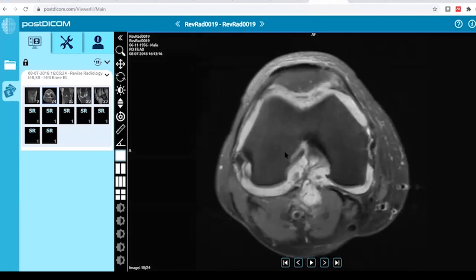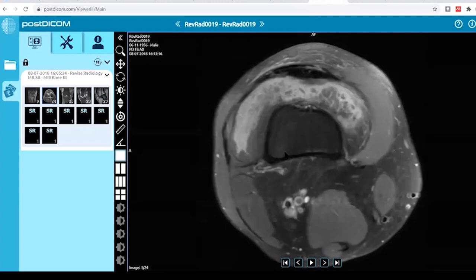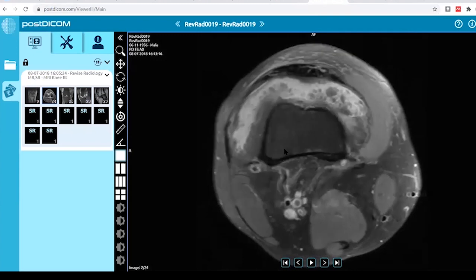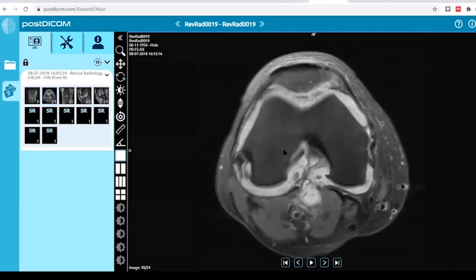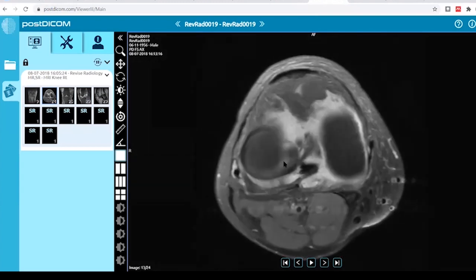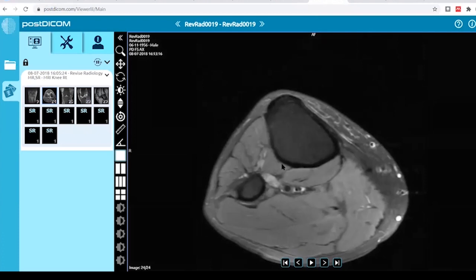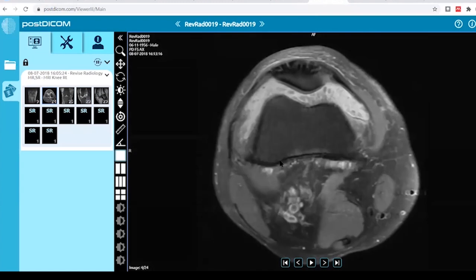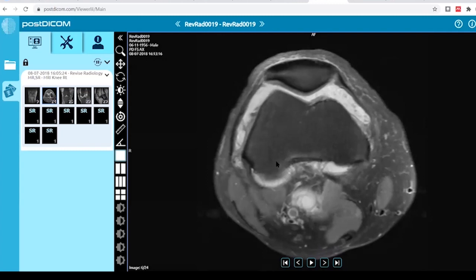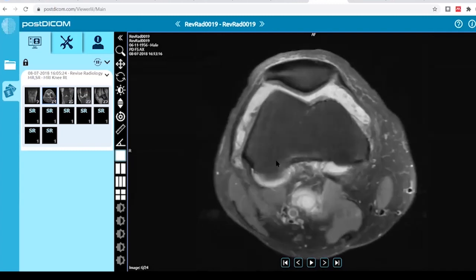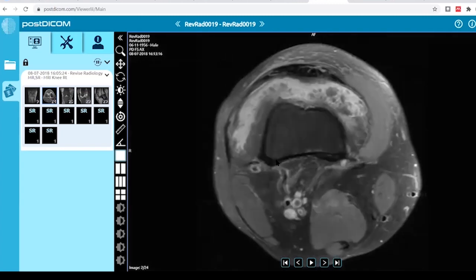This is an MRI knee of an adult patient, fat-saturated sequence. It shows the standard suprapatellar pouch as well as the infrapatellar pouch with high T2 signal within, not suppressed by the fat-saturated sequence. There is synovial thickening with low T2 signal seen within the effusion — some are linear and some are rounded, with low T2 signal within.